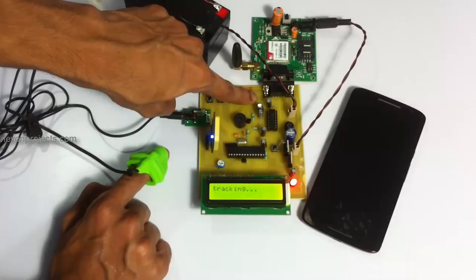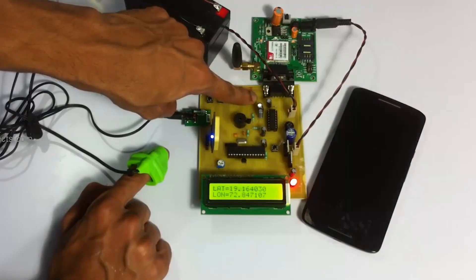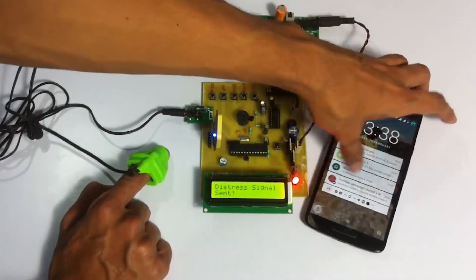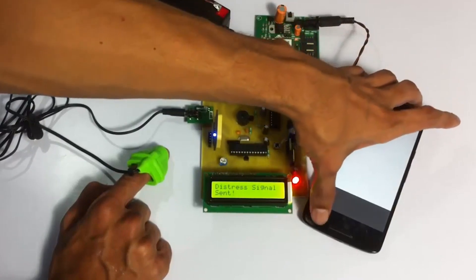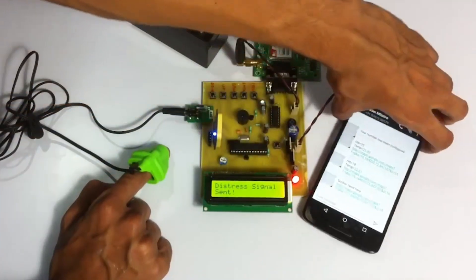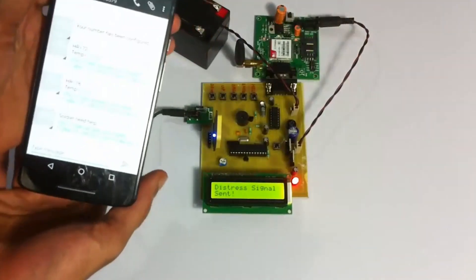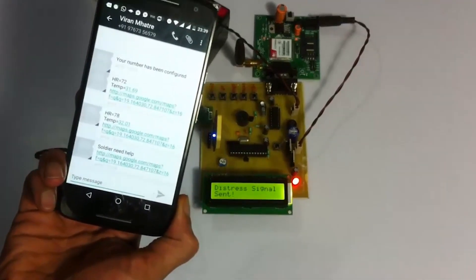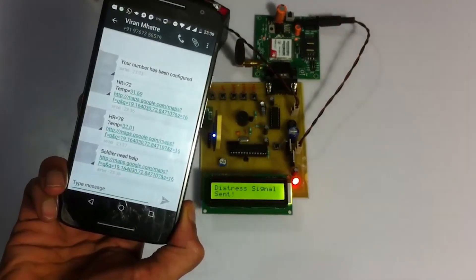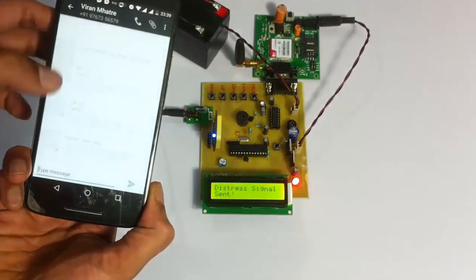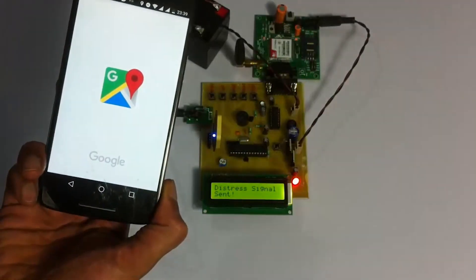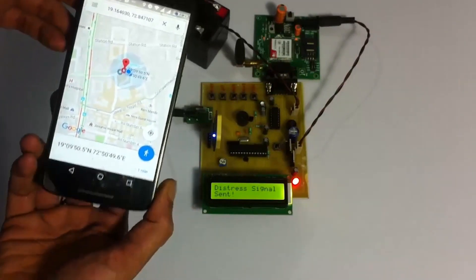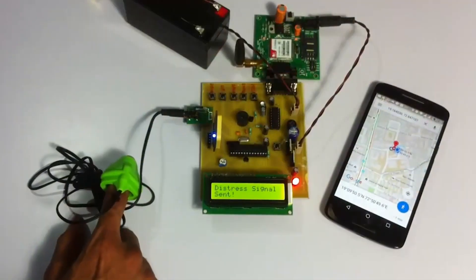There's also a distress signal here — the help button. When we long press this button, it sends a distress signal. As you can see, it's also displaying on the screen. It shows the distress message that the soldier needs help and has pressed the distress button. This is his coordinates on a map. This is how the project works.